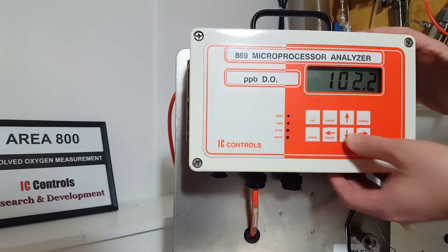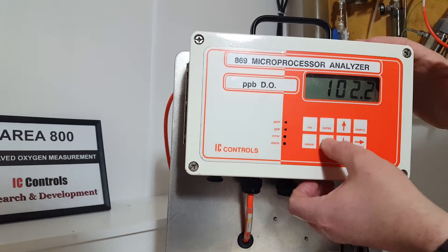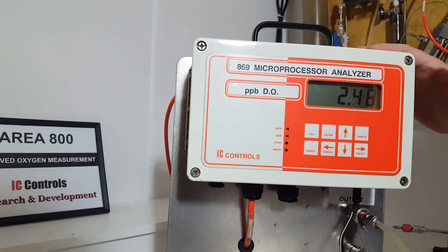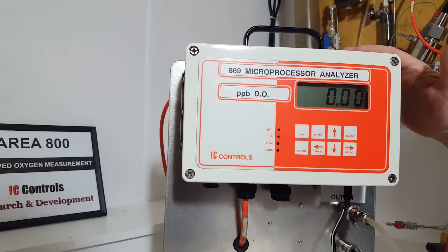If you go down another one, you're into your pressure, which is in kilopascals. If you just hit sample, it always takes you back to home base. And that's your basic overview.